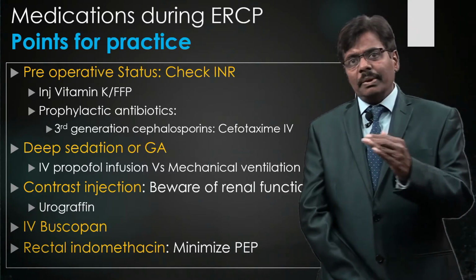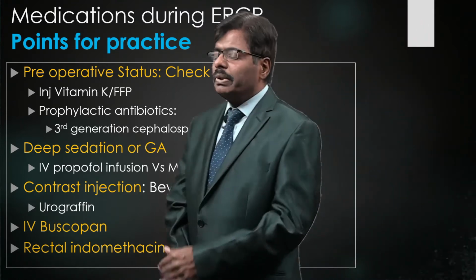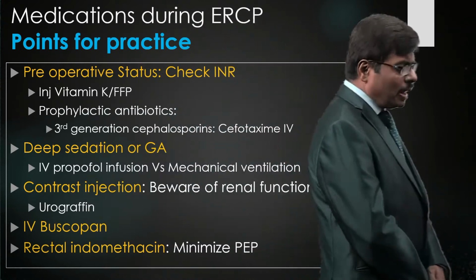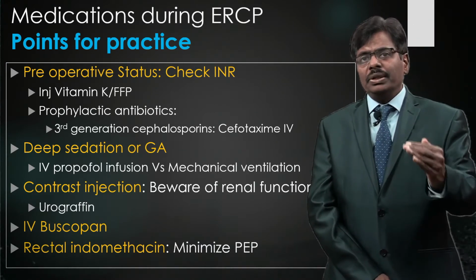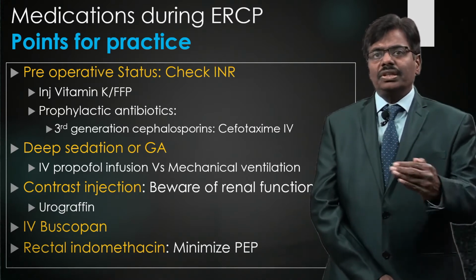The second thing is coming to the anesthesia part. Even though I am sure a large number of people do the ERCP under deep sedation, in my opinion, for the first few cases, especially when you have a mentor and you are having your time, better you do it under GA with an anesthetist present. That takes a lot of stress off you.